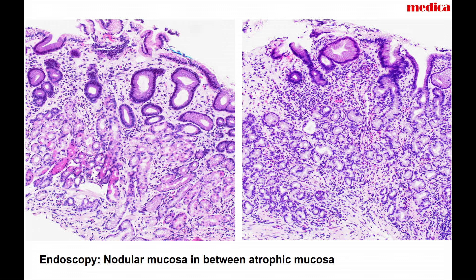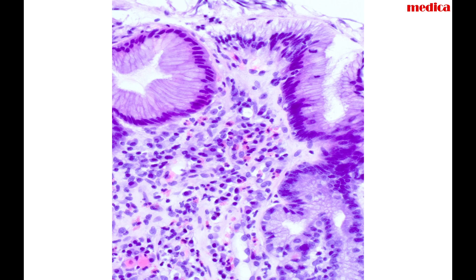What you also can see is quite pronounced infiltrative lymphocytes, plasma cells, and also quite a lot of eosinophilic granulocytes. And here you see the infiltrate by the lympho-plasma cells and eosinophils.